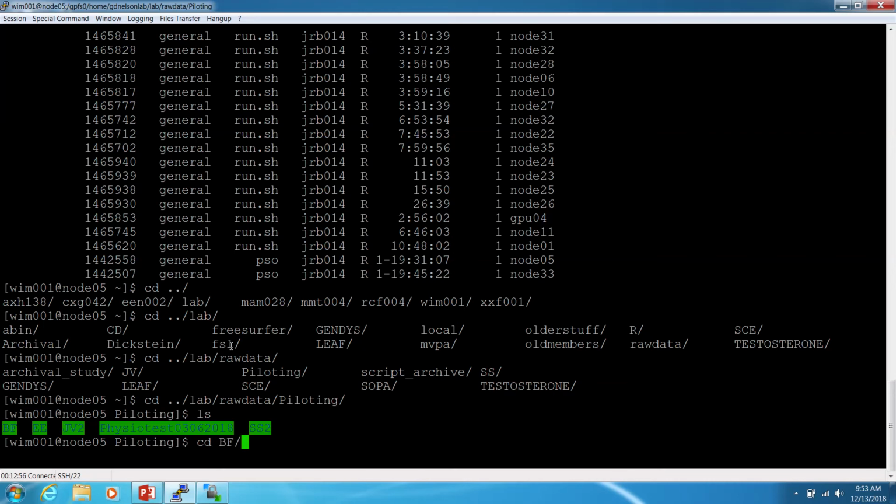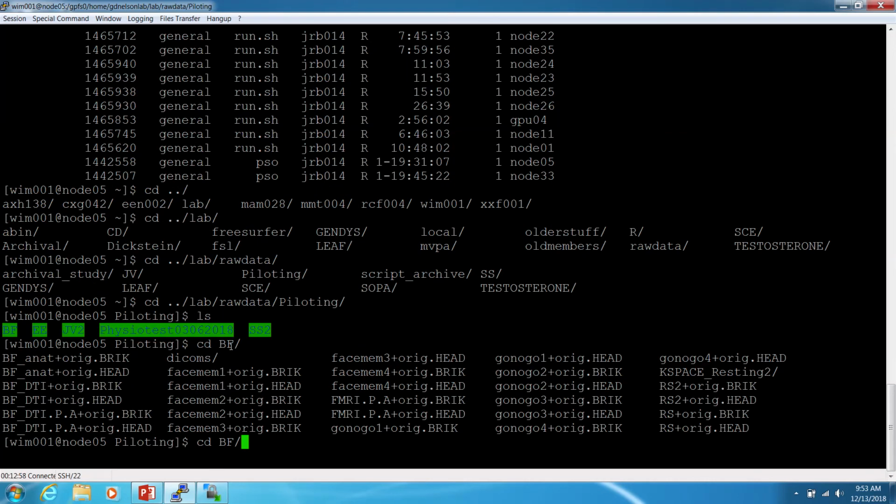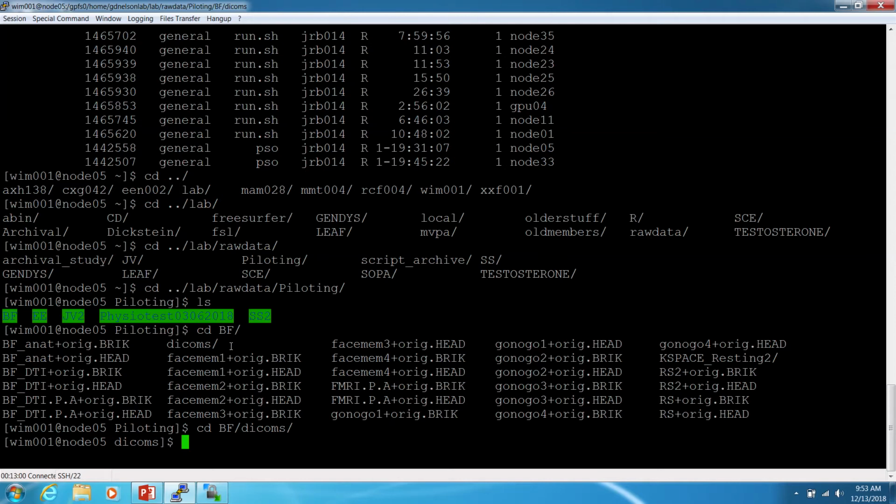So the next thing that I wanted to talk about is to start us along the stream of how data moves, from when we run a task at the scanner to now we're actually wanting to run our data for real, to ask questions about what's going on.